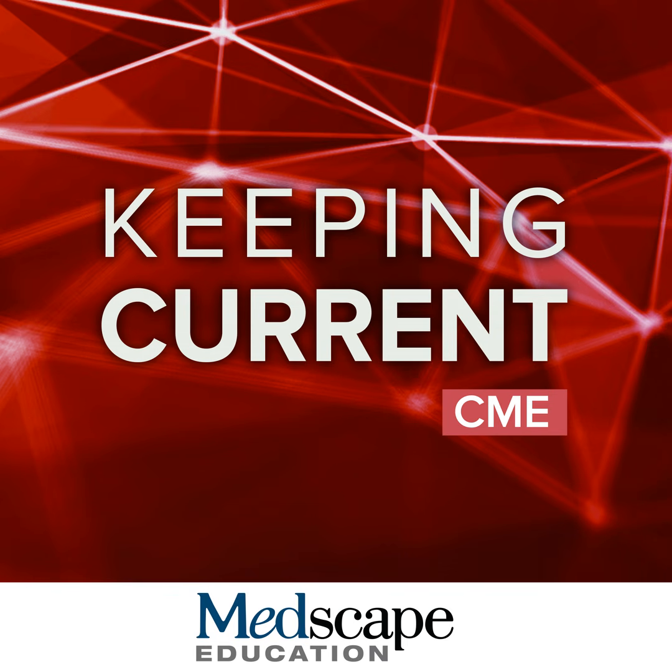On the other hand, this is the second patient who actually started at 88 Centiloids in a positive scan and has persistent positivity at the 18 months. And so that would be a very important clinical discussion to have with that family about whether they should continue with the same therapy, switch to a different therapy, or discontinue therapy.